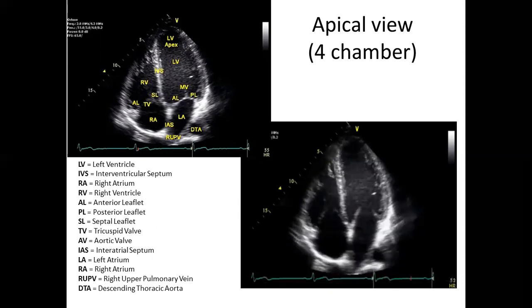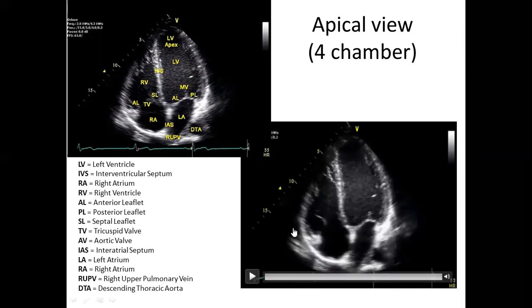You can see how both of these valves are simultaneously opening and closing. You can see the contractions and rarefactions of the myocardium. And again, that is happening simultaneously, which is going to be the normal appearance of both morphology and function of the heart. Again, guys, please check out these abbreviations and what each of these letters means.